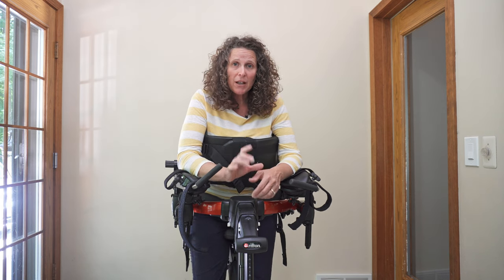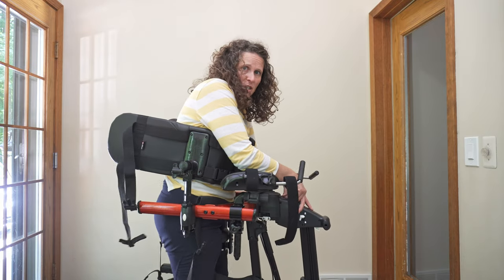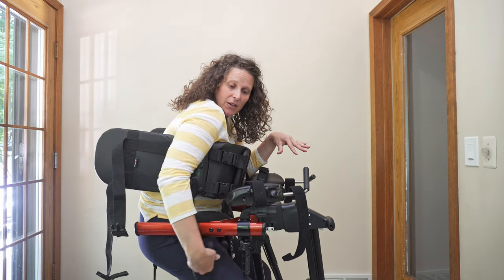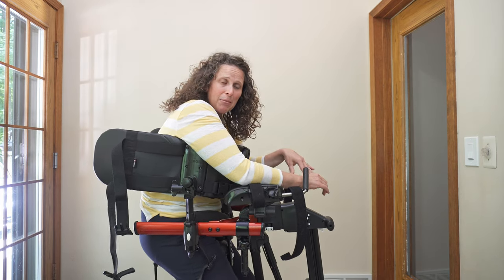A lot of times a person who has a kyphosis also tends to sacral sit, so they are in a posterior pelvic tilt. A lot of times their chin is down, or their hips are back and their legs are forward, so that it is really difficult to step.